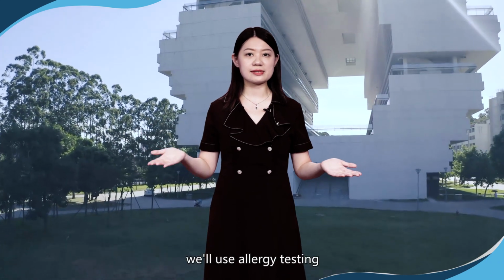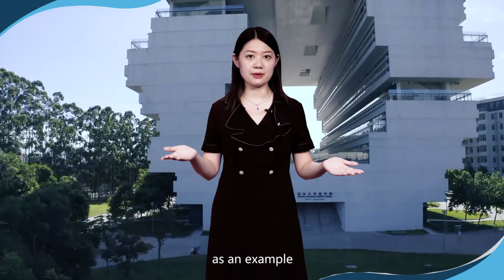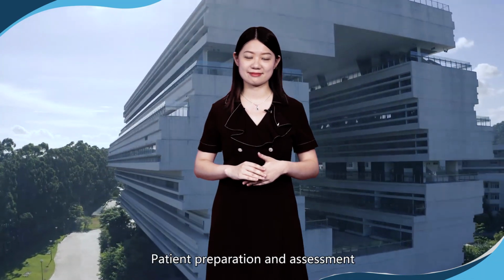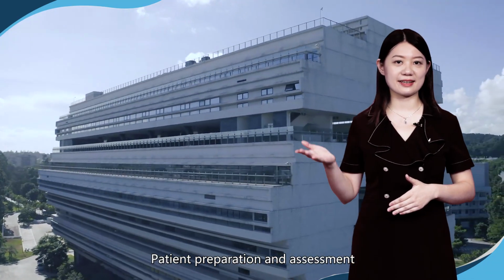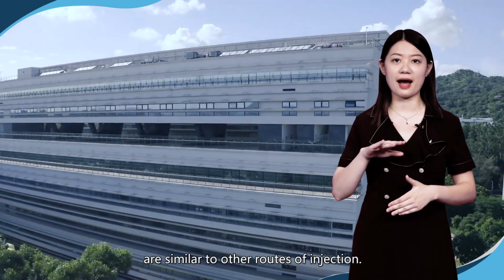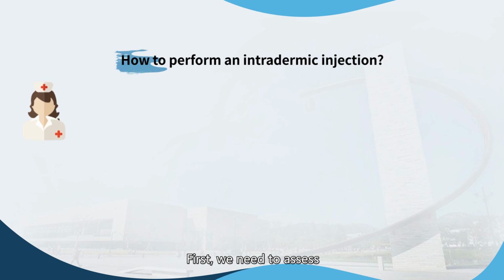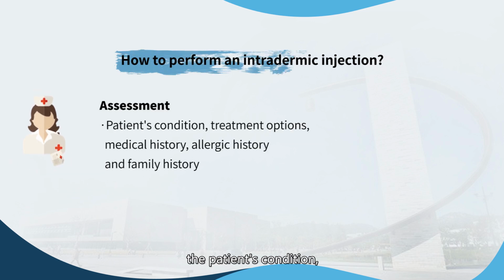Today, we'll use allergy testing as an example and go through each step of intradermal injection. Patient preparation and assessment are similar to other routes of injection. First, we need to assess the patient's condition, treatment options, medical history, allergy history, and family history.